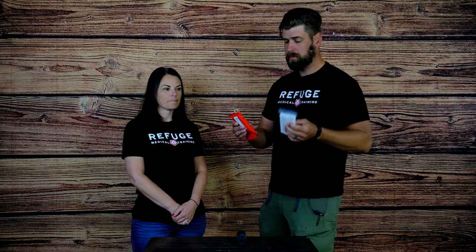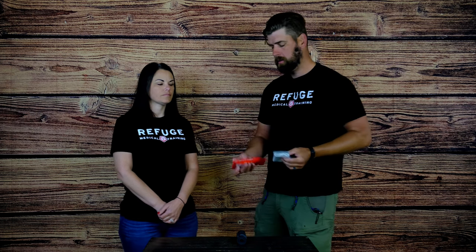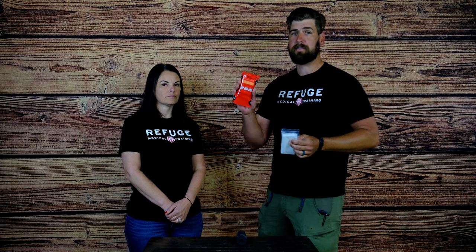A couple of different differences between the two is the S-Mark is thinner and a little bit shorter — this is about two and a half feet long — and the SWAT-T is about five feet long and it's thicker.